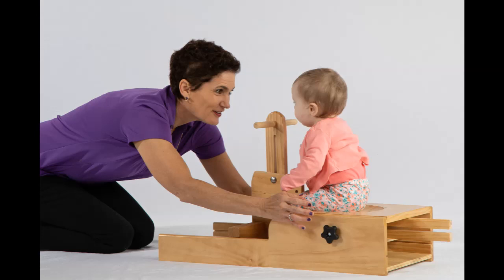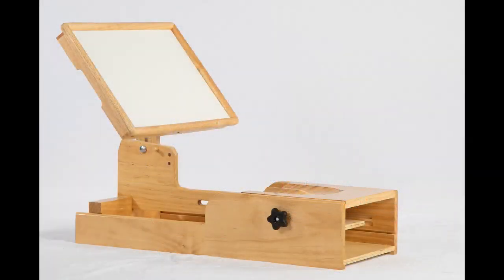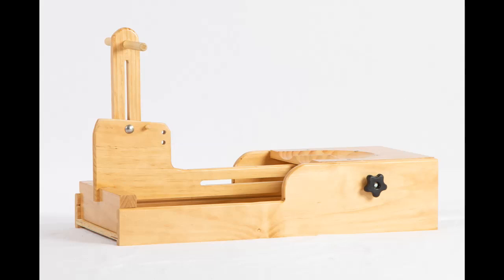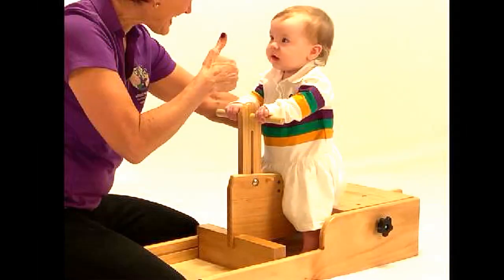Annie's chair can have trunk support added or removed to the contoured seat. An adjustable tray top with many angles for upper extremity weight bearing. This tray top can be removed exposing a pull-up bar for standing. Once a child has learned to pull up and stand, the bar can slide in and out for pre-gait activities.